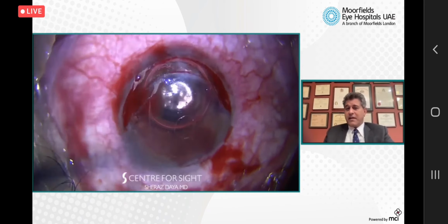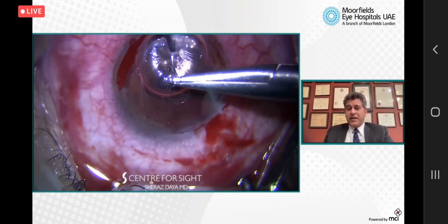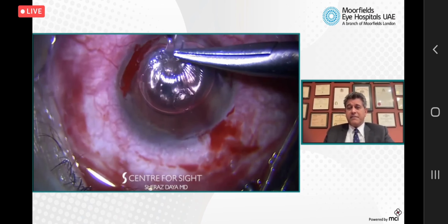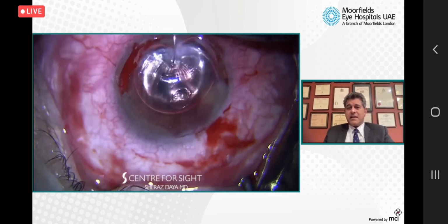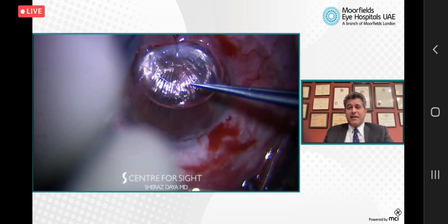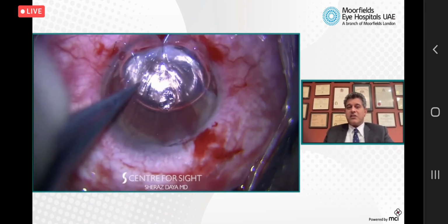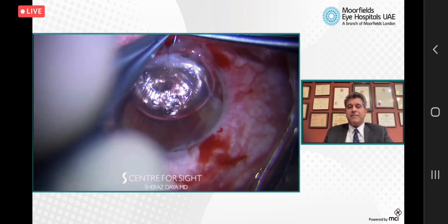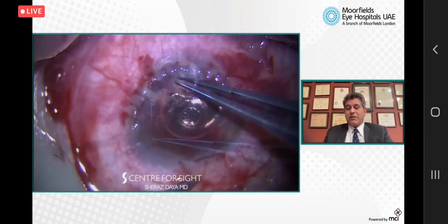I'm going to be suturing that cornea back to itself, invaginating that Descemet's membrane. And it looks terrible when you're putting these sutures in. As I say, the cornea looks really egg-shaped, but you've got to believe it does work. It does correct the astigmatism. They're overcorrected to begin with, but it does ease up over time. So you can see the striae there, but once we've got all the sutures in, it looks a lot better.